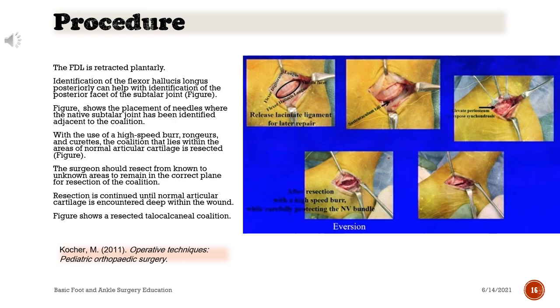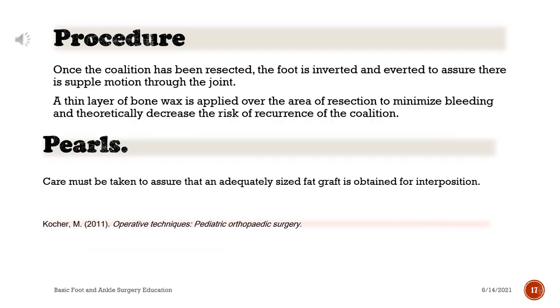With the use of a high-speed burr, rongeurs, and curettes, the coalition that lies within the areas of normal articular cartilage is resected. The surgeon should resect from known to unknown areas to remain in the correct plane for resection of the coalition. Resection is continued until normal articular cartilage is encountered deep within the wound. Once the coalition has been resected, the foot is inverted and everted to assure there is supple motion through the joint. A thin layer of bone wax is applied over the area of resection to minimize bleeding and theoretically decrease the risk of recurrence of the coalition.